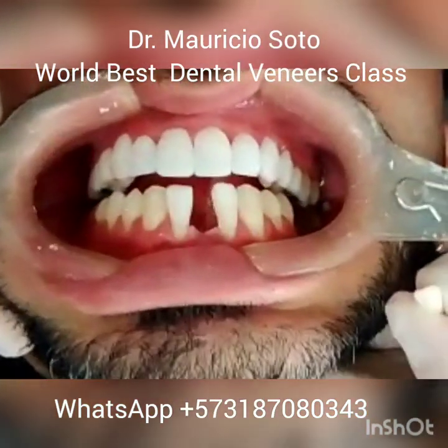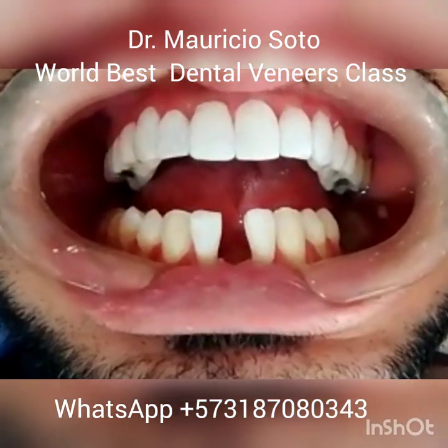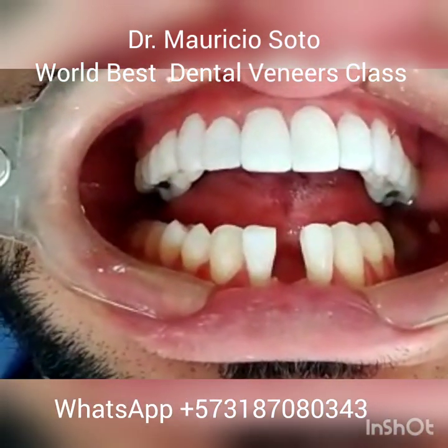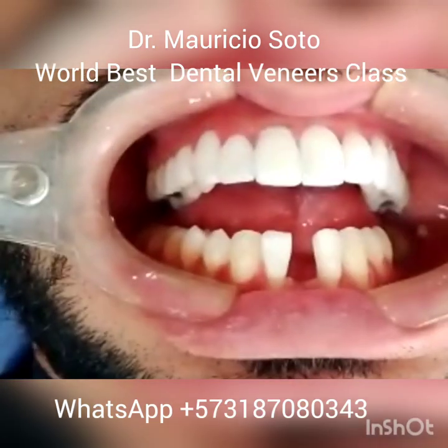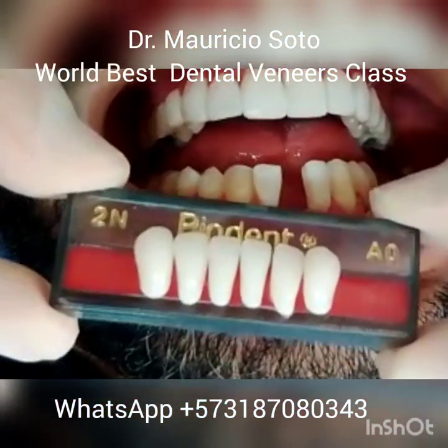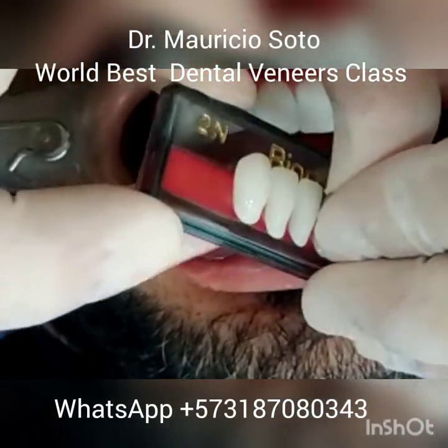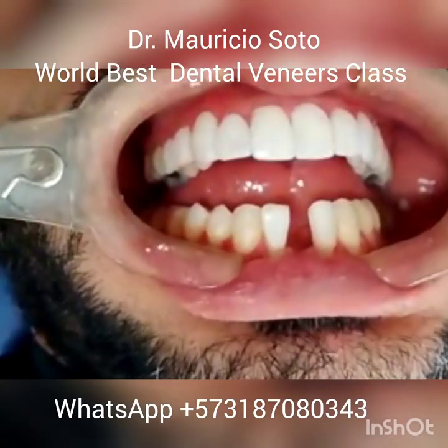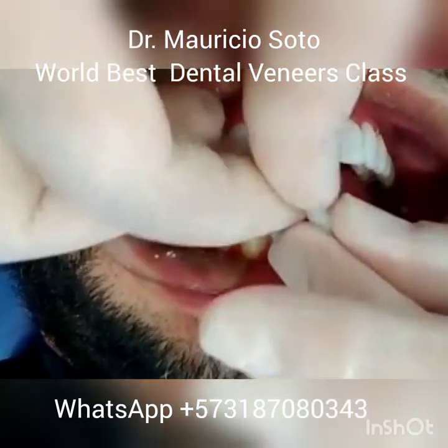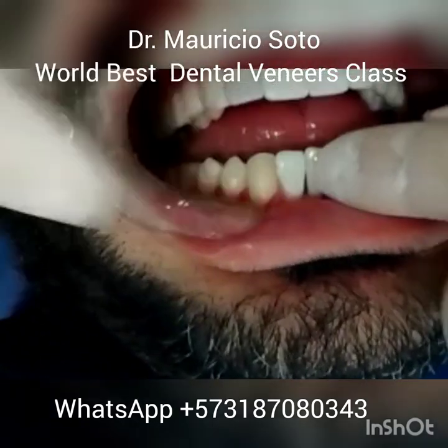We have seen the initial situation — a lower incisor that shall be replaced. We are going to use a denture tooth. You choose one with the right color and the right size, and we use this tooth to replace the missing tooth.